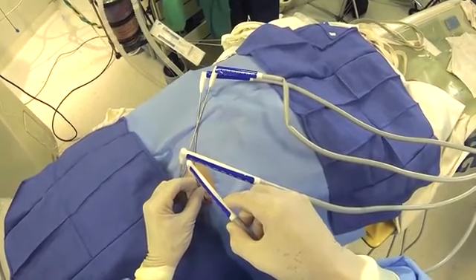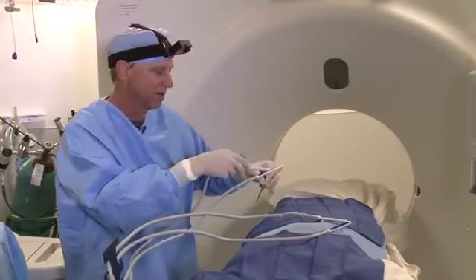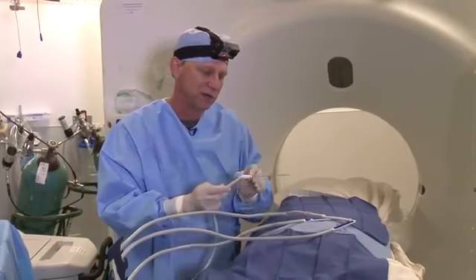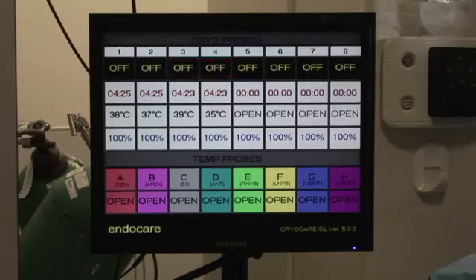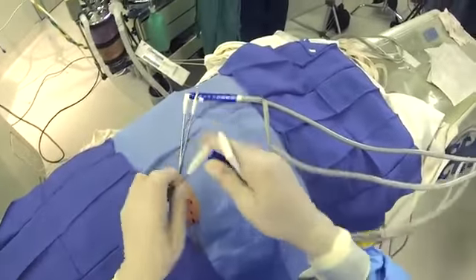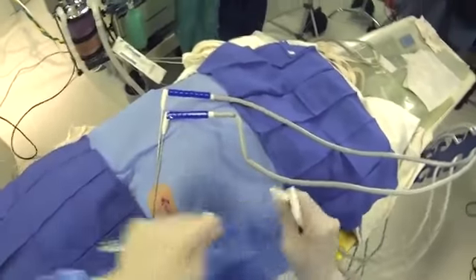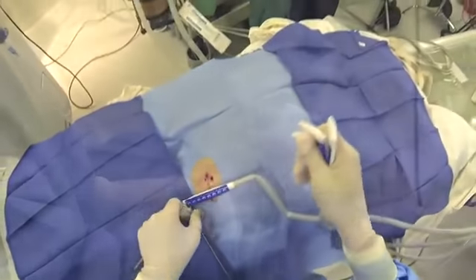Sometimes the ice will hold the probe even though the temperature indicates that you should pull them out. What we do is we turn off the stick at this point just to stop the helium cycle, and we just give these a twist so as to safely manage these probes. And we can bury these in the sharps container.